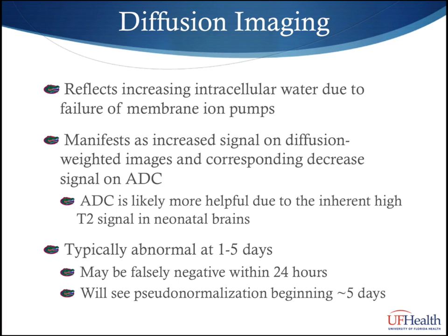It's very important to note that diffusion may be falsely negative within 24 hours, and it may pseudo-normalize beginning at about 5 days. Later, we will discuss the optimal imaging time for neonates with suspected HIE, and this will be one of the important points to remember. If your imaging protocol includes neonates scanned within the first 24 hours or after 5 days, diffusion imaging may not be entirely accurate in predicting injury and should not be used as a sole predictor.